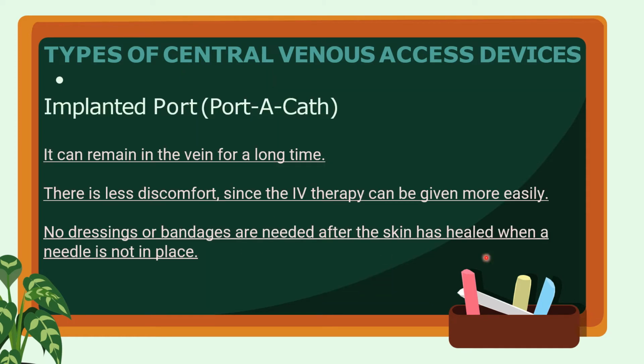So the advantages of using the implanted port or the port cath include the following. It can remain in the vein for a long time. There is less discomfort since the IV therapy can be given more easily. No dressing or bandages are needed after the skin has healed when a needle is not in place.